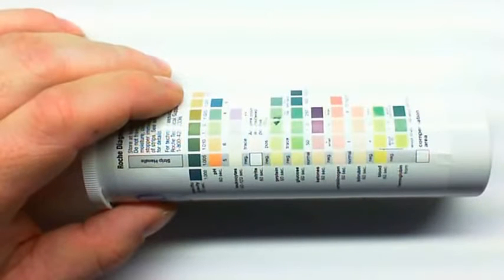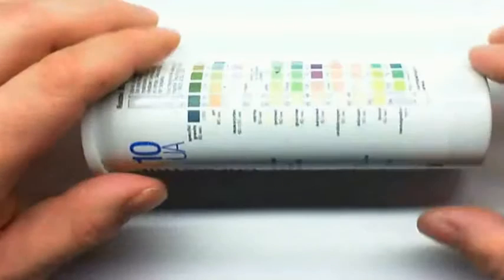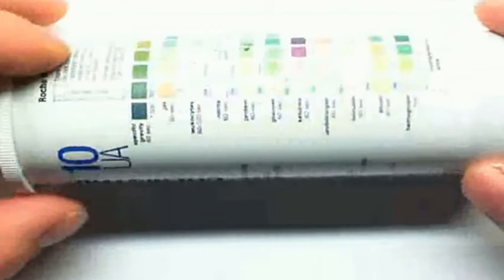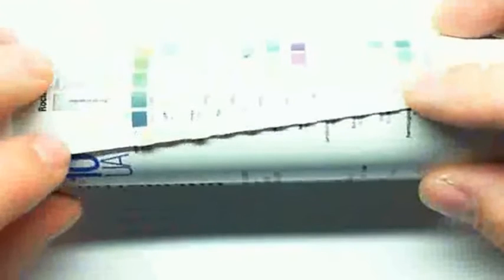Now the first thing I want to show is the actual bottle, and I don't know if you can read it real well, but I'll narrate a little bit. This first line is specific gravity, and what you're going to do is take your urine strip that you've dipped in urine, and then you wait 60 seconds and then you read. One key is to make sure that you're lining up the strip handle so that you don't invert your readings.